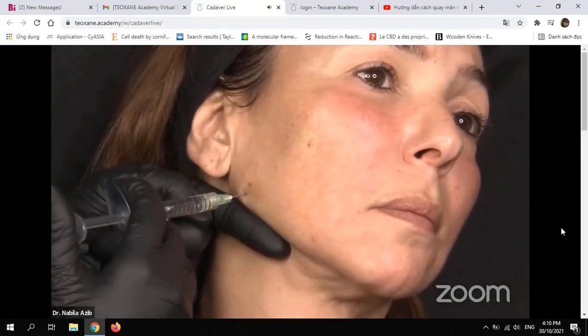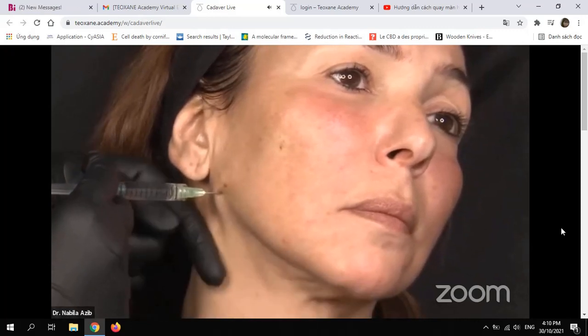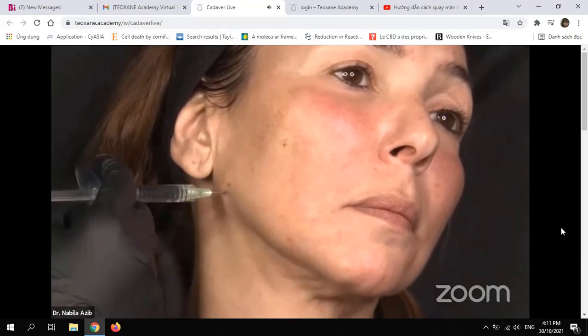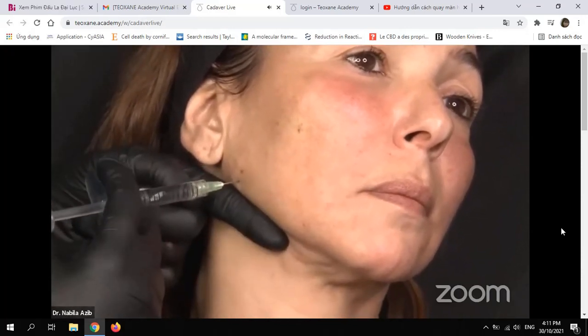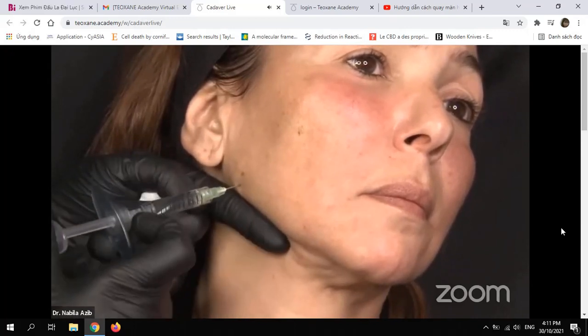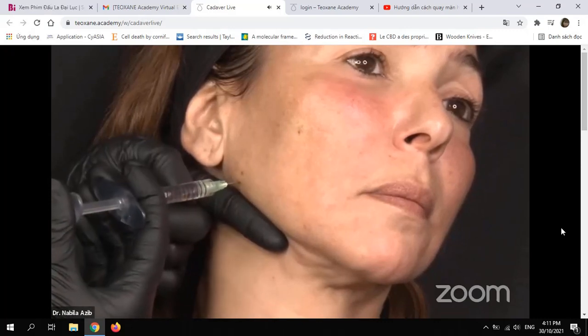So here, it's just a habit, but I'm always blocking the flow of any vessel that can come. But I know that in the mandibular angle I don't have that. But this is a thing that I will do also in the chin or any other area where I need, like when I do the nose, for example, to pinch the flow coming, the blood flow. So here I injected already deep into the bone 0.2 ml.